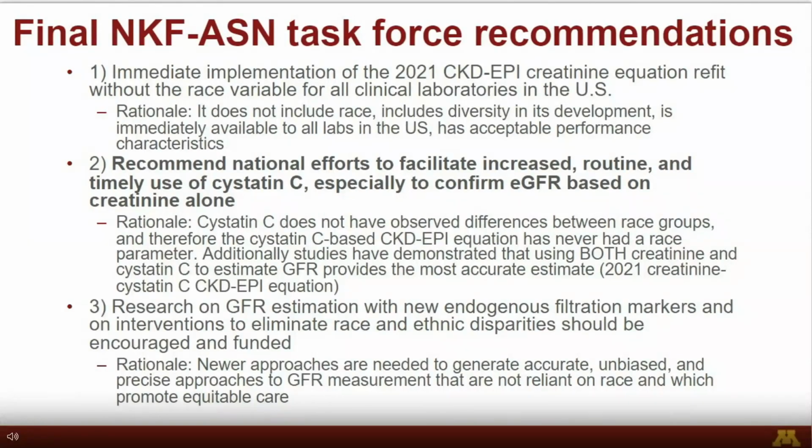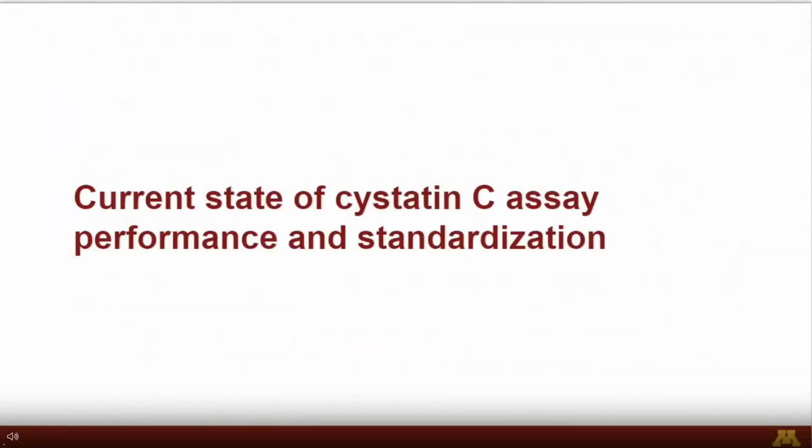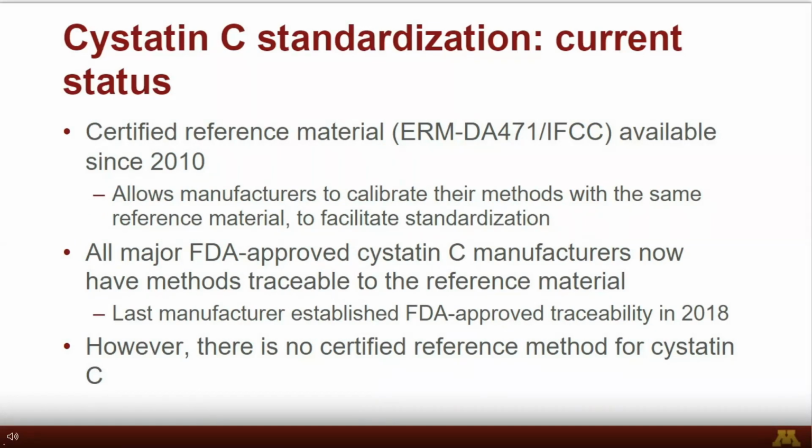So if we are to increase use of Cystatin C testing, it's important to understand the current state of Cystatin C assays and discuss how best to implement more widespread testing. First, I will focus on the assays themselves. An important issue to consider is Cystatin C assay standardization, as you would want results between laboratories to agree if all labs are using a standard equation to estimate GFR.